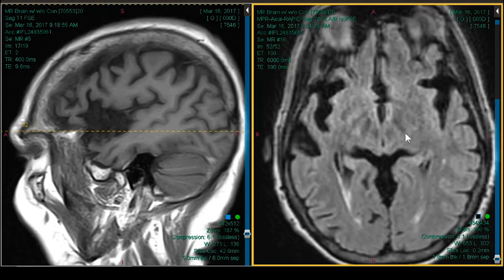Again, it's very frontally oriented. It likes the anterior portion of the temporal region. I like to look at this sagittal projection because look at what it's doing to Broca's area. I mean, it is just crushing Brodmann area 45 and 44.